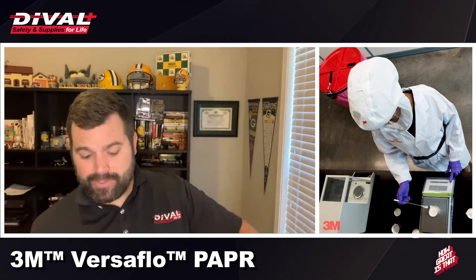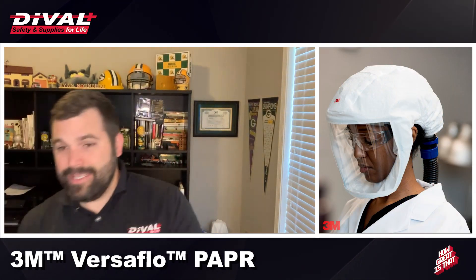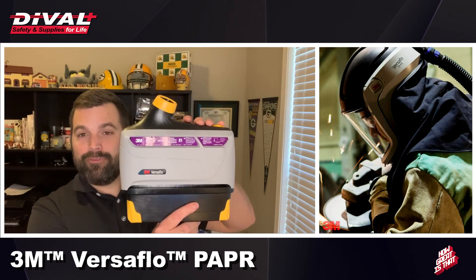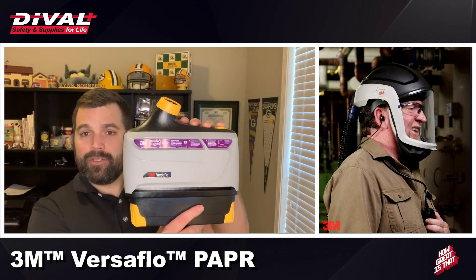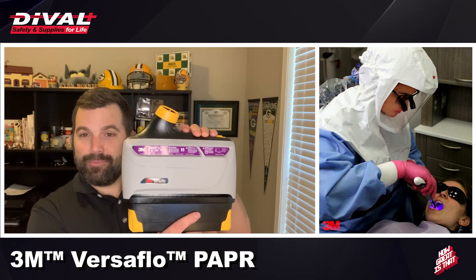There are certain environments that require even more protection — enter the TR-800. The TR-800 builds off of the TR-600 but is an intrinsically safe electronic device, so any environments requiring intrinsically safe protection are covered by the TR-800.